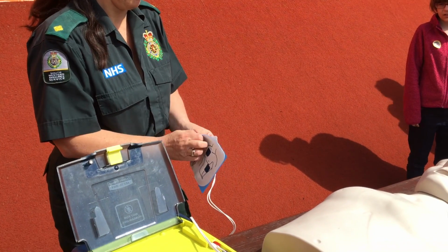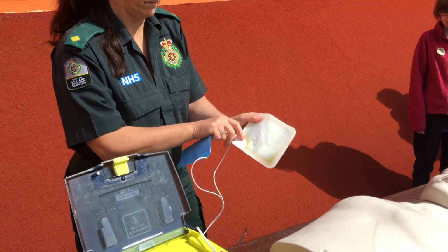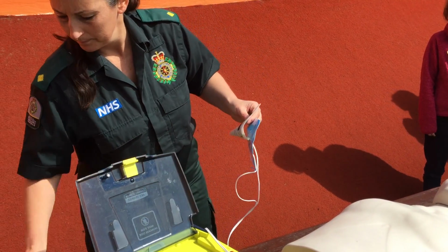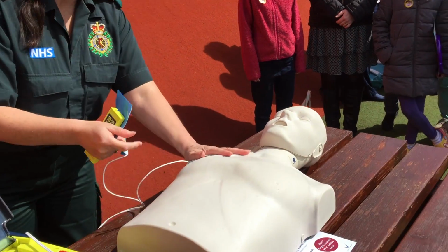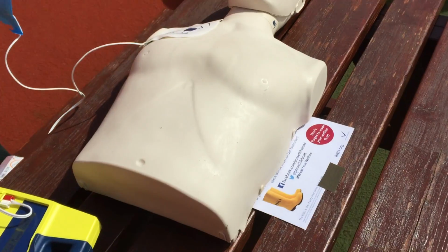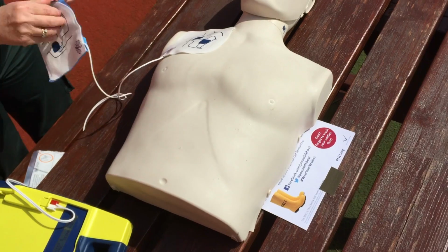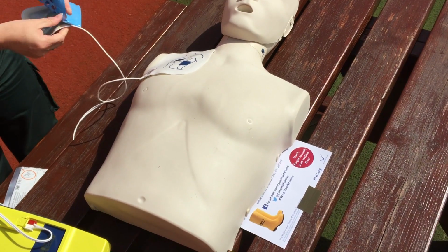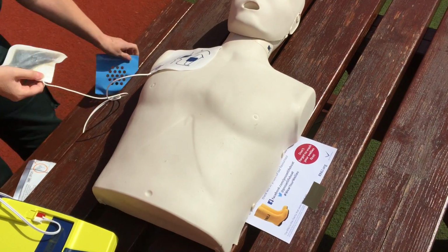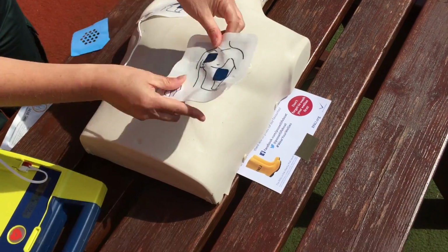Peel one pad from the plastic liner. Place one pad on the bare upper chest. So one pad's there. Peel the second pad and place it on the bare lower chest as shown.